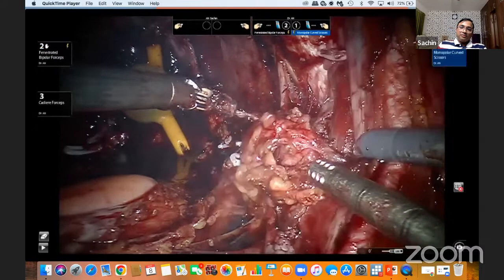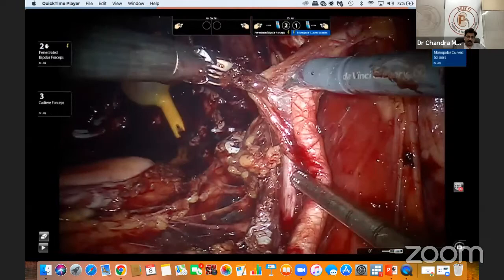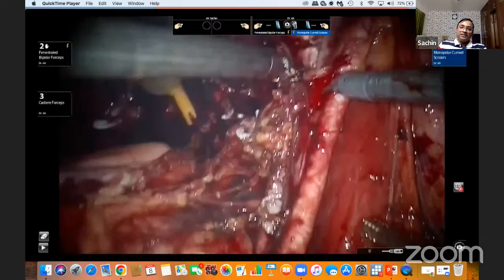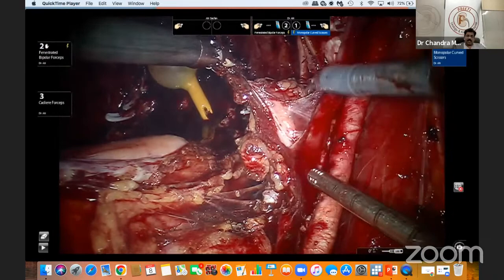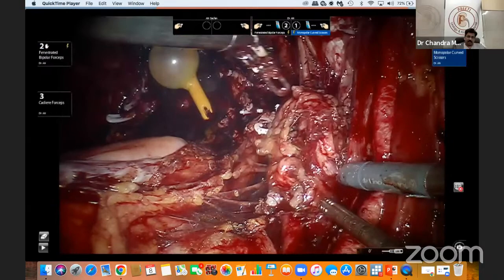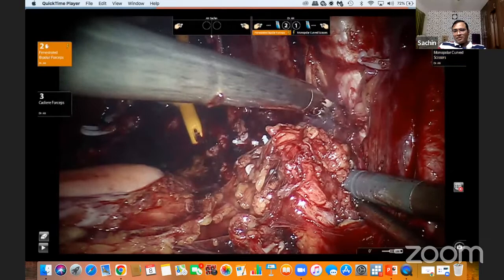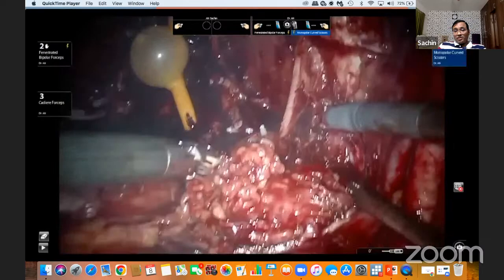So it's still attached to the big one. Do you dissect all branches of the internal iliac vessels and remove everything anterior to that? Internal iliac vessels, we cut it off. So this I showed. The medial umbilical ligament is cut off. No, I'm asking about radical prostatectomy. When you are doing the lymphadenectomy, do you dissect all the branches and remove all the anterior lymphatics? No, I just remove the obturator packet and external iliac packet. That's it. I'm not aggressive in prostate when doing lymphadenectomy. I'm very aggressive in bladder.